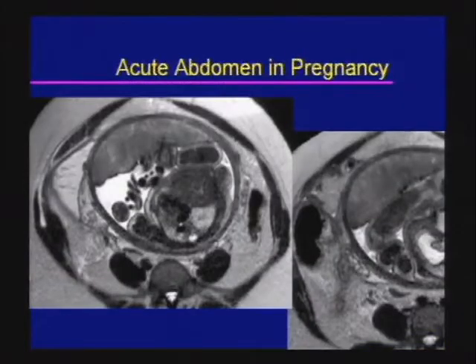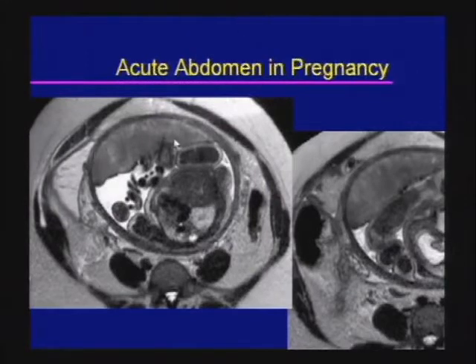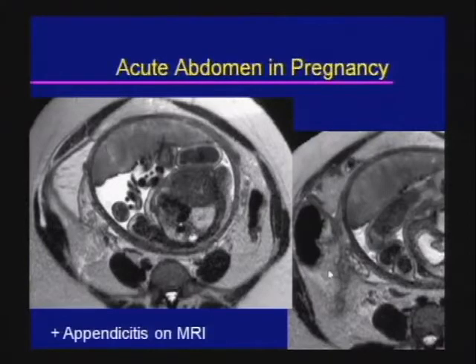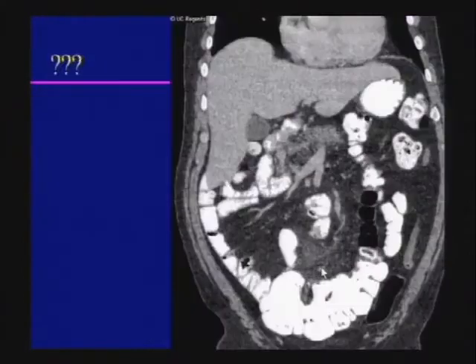This MRI is from a pregnant patient. We see the gravid uterus with the anterior placenta. Note there is obvious right lower quadrant fluid and a dilated, abnormal-appearing appendix. This is acute appendicitis on MRI.